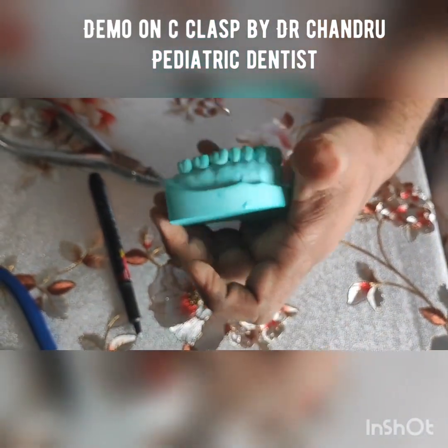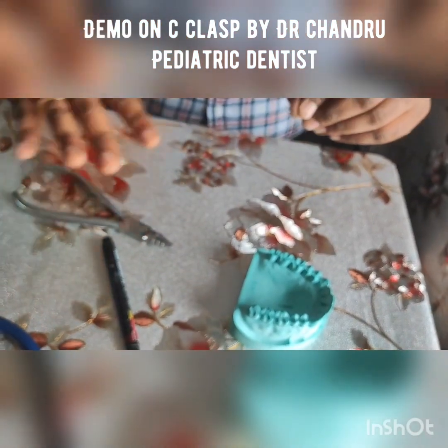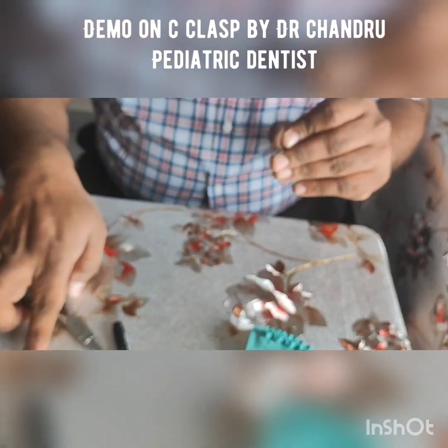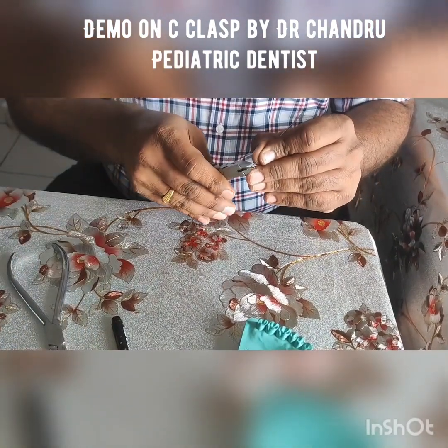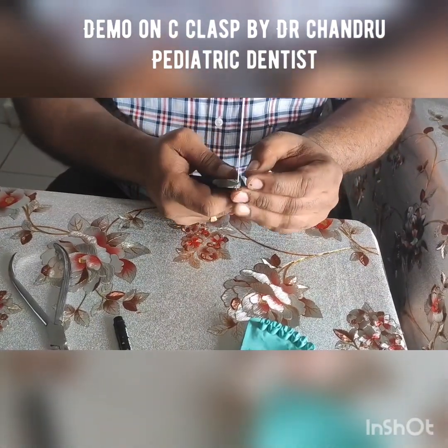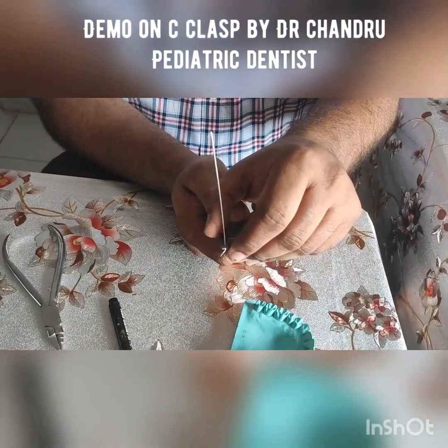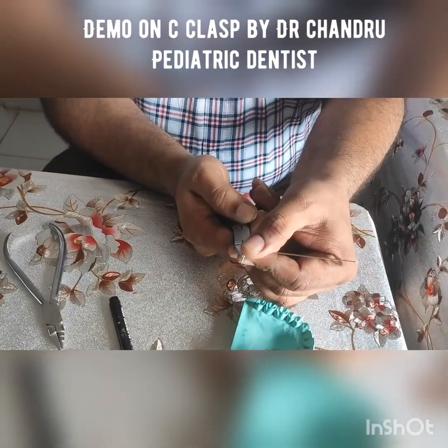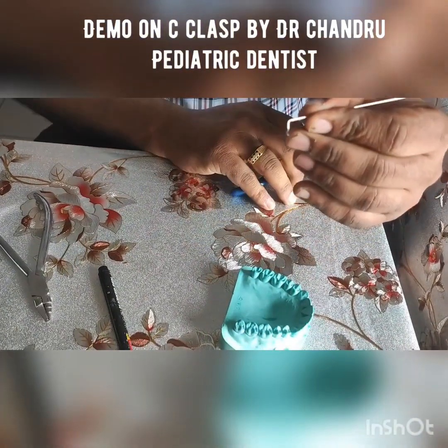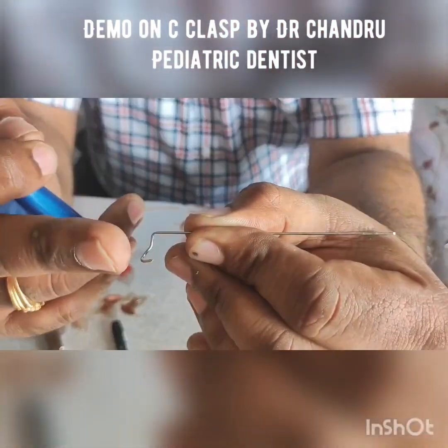Once the marking has been done, the way you held it and placed it on the cast, similarly the same way it has to be placed on the cast, and the angulation should also be held at the same level. So you have to hold like this and a 90-degree bend is given in a downward direction. So this will be the first, the construction of the C.